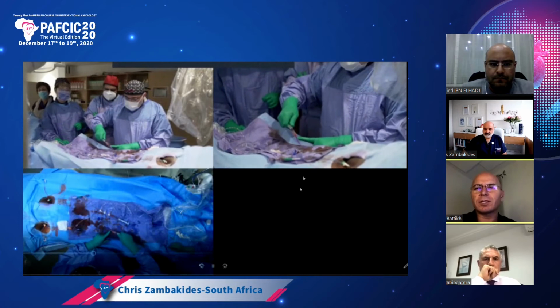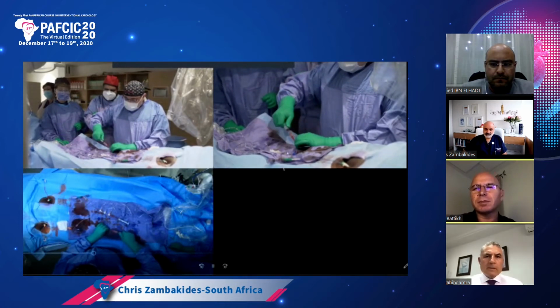Excuse me, Chris. Can you focus on the angios? Otherwise, you don't get blood back.